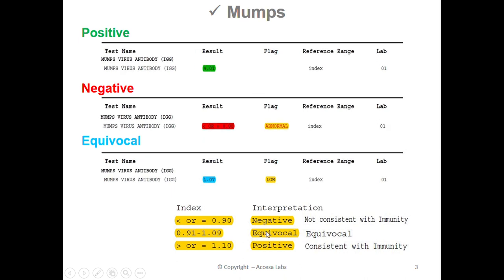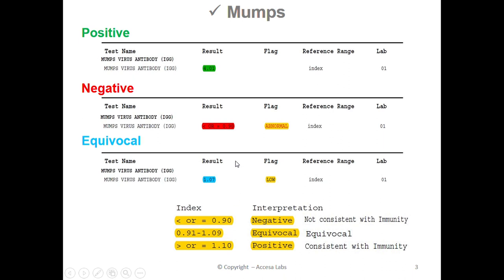Next, let's review a few AccessaLab sample reports to help you learn how to interpret the mumps titer results. This sample report has a result of 4.01. Based on the Quest Diagnostics Result Index shown here, any result greater than or equal to 1.10 is positive, which implies that a person with this result has immunity to the mumps virus. Therefore, this sample report represents a positive result.